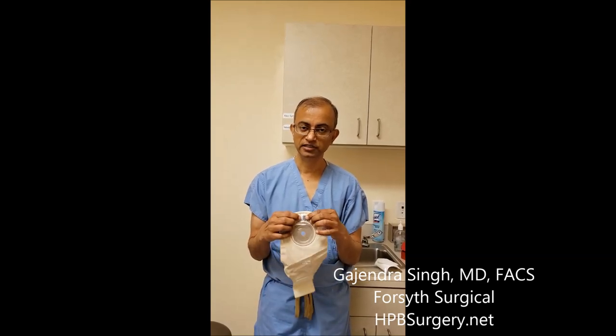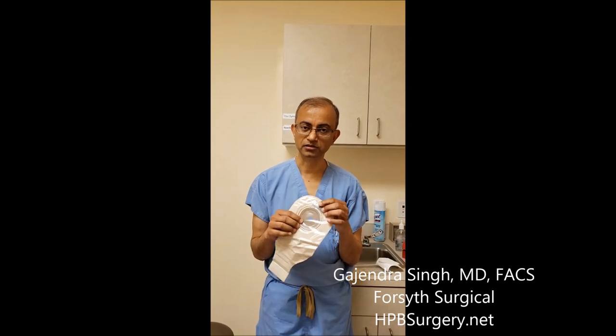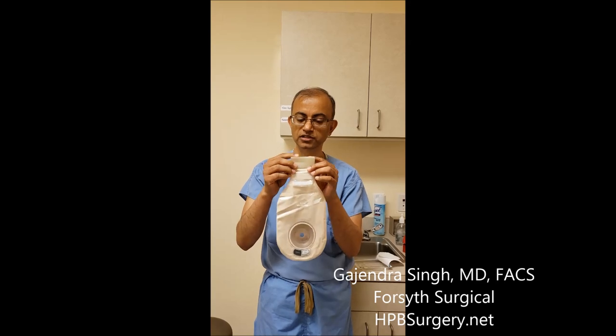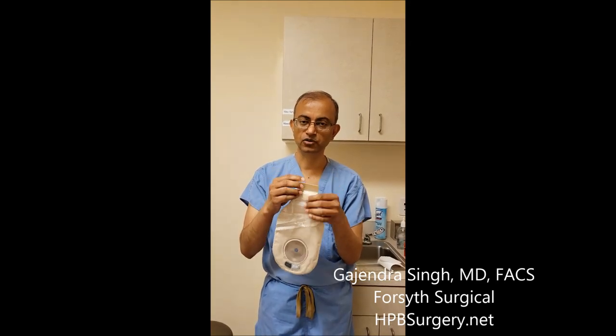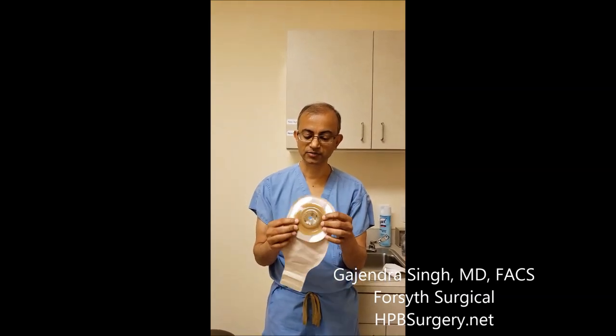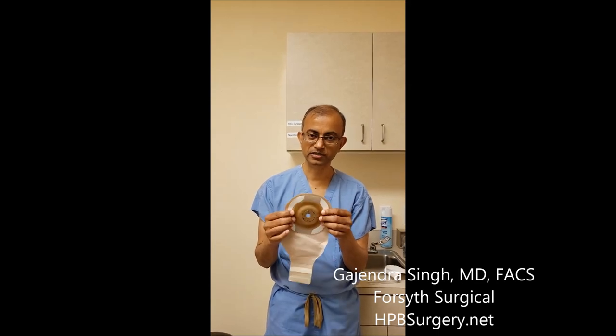These two little things are a vent port where the gas comes out slowly so the bag doesn't pop. The bottom just rolls on and you use the Velcro to close it — there are different options like clamps and clips. This is the easy one: you cut out the circle to match your ostomy size and put it on.